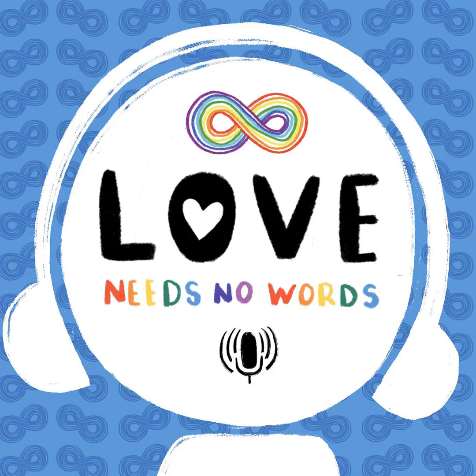So for example, "like" might be the first button I might suggest to someone, or we had chatted through with the family about what they want to do. But it's such a great word to start with, because you can just go, yeah, I like, and I would imagine I'm pointing, the word's coming out, and there's maybe 66 buttons on this page, and I'm pointing going, yeah, you like that. I like that drawing. I like your shoes. Yeah, do you like going to see Granny, or you like going to soft play, or I like sausages too. And it's one you can just drop in with no expectation that your child's going to do it back. And honestly, that is enough for you to work on at once.